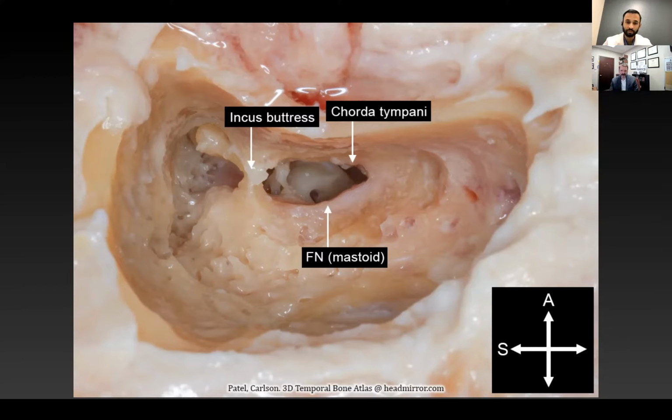Some people it's solid bone. Some people it's hyperpneumatized. When we're talking about the posterior bony ear canal and the facial nerve, I think it's also important to visit this idea that almost every important piece of anatomy becomes plated before you see it. So you'll enter all these air cells around things, but when you get close to any important anatomy, almost always there's a bone plate around it. So the posterior bony ear canal, you can keep removing honeycomb bone until you get a plate. Over the facial nerve, almost always there's a plate of bone over it. The dura, the sigmoid, almost all of these things have that.